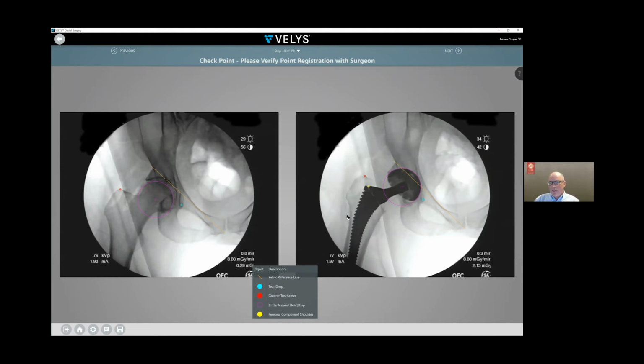This technology will instead get you to the point where you take an x-ray, you work, take another x-ray, you get data, and then you can make a decision what's best for the patient. So my workflow is I take the x-ray on the left here, either before I make my neck cut or while I'm at the scrub sink. Once this x-ray on the left is taken, which is the hip before I operate, I'm off and running as a surgeon. I'm making my neck cut.